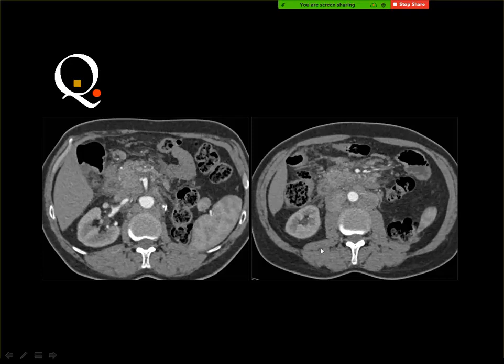The kidney is exactly similar to the breast. They use it as a clue in the exams or in clinical practice. If you see a missing breast, you consider the patient to have breast cancer and interpret the exam from this practical point.